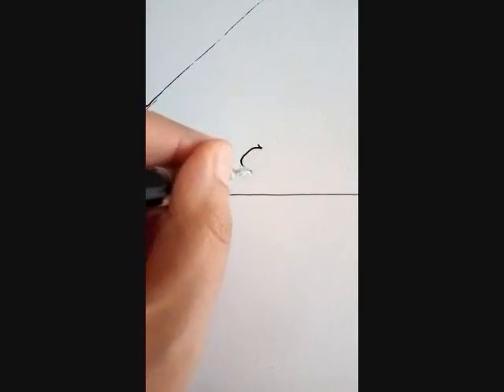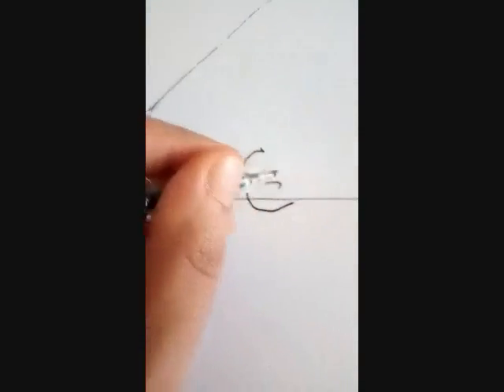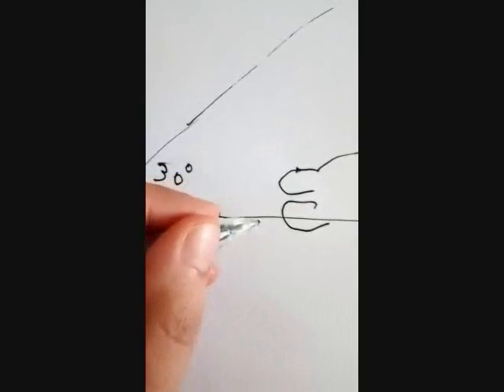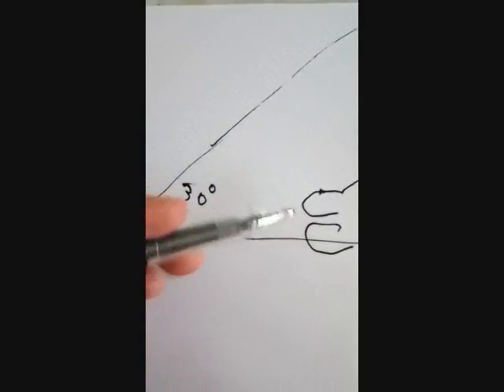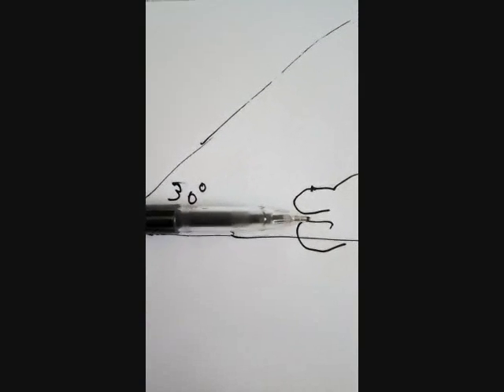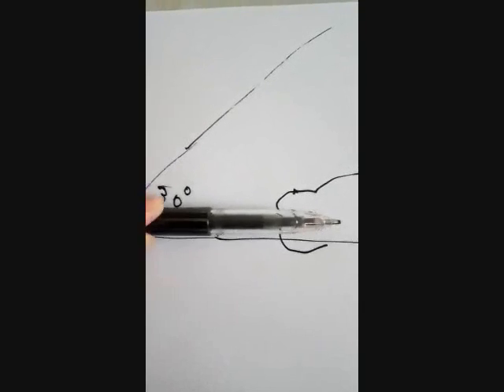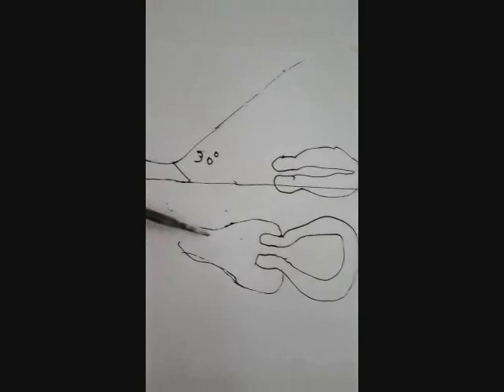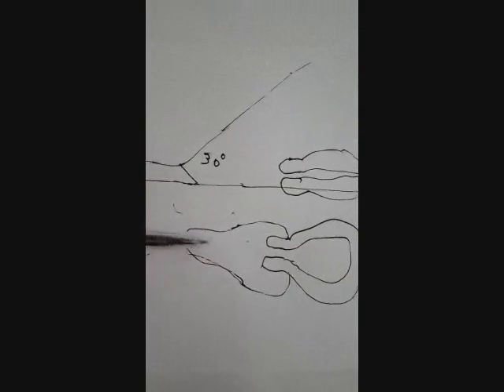So here's a demonstration. You have the cervix. What the scope sees is between the two straight lines. So this is a 30 degrees scope. We put the cervix down at 6 and we advance the tip millimeter per millimeter, very slowly. So here's an example.